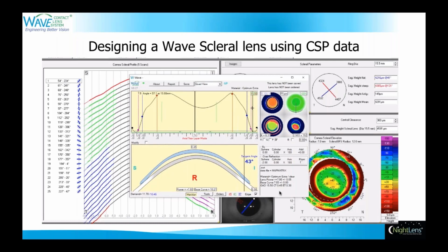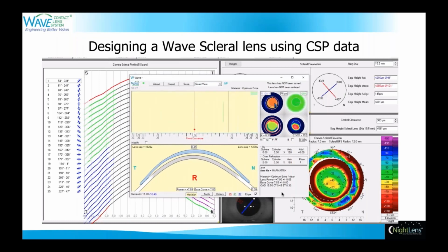I didn't highlight this area, but you could hit the edge button at the very bottom, and it would magnify the edge. Looking at the analysis of the cornea, the graphical analysis of the cornea and the lens down below, you can see where the cornea, which is gray, turns white. And of course, that's where you're looking at the sclera, okay? Front surface optics are maximized, and change as the base curve of the contact lens changes, to maximize the best possible vision. So that happens automatically.